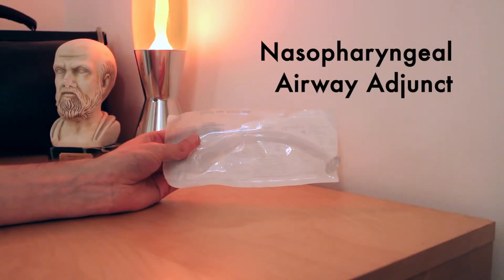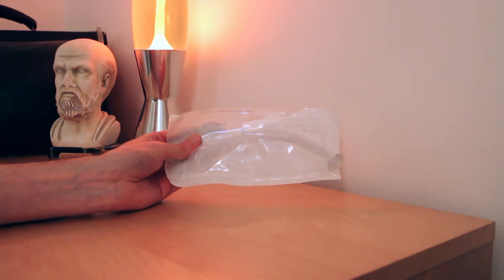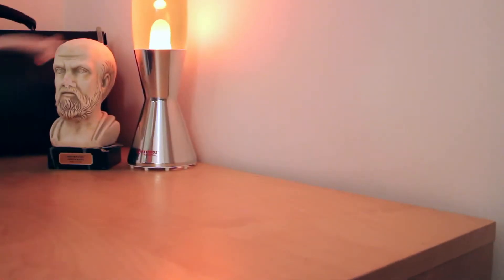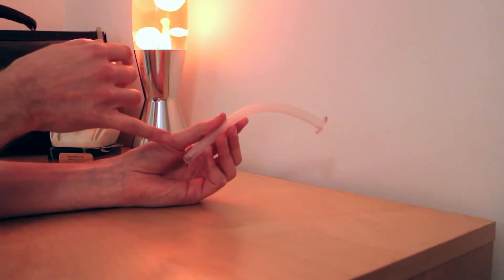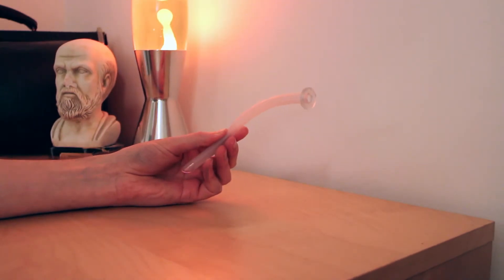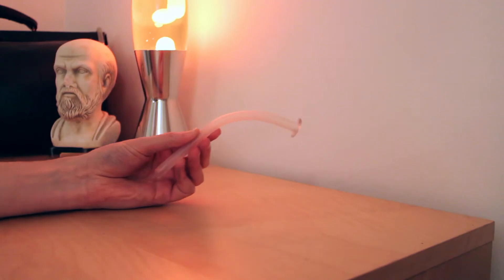This is a nasopharyngeal airway adjunct. It is a single use device and comes in a sterile container. You can describe it as a flexible plastic tube that is curved with a flange at one end. Some of these are fitted with a safety pin, although the safety pin should never be opened.